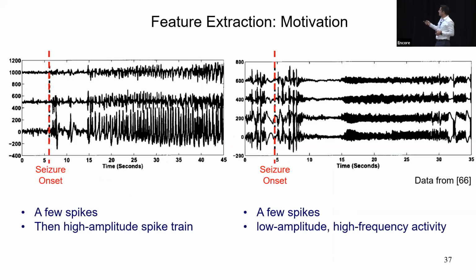Now, if you look at signals that are recorded from IEEG or intracranial EEG, where electrodes are implanted, we see that first of all, the manifestation of seizure is actually quite different. The signal magnitude and the resolution that we can get from the signal is quite different from scalp EEG, and again, from this patient to that patient, we have very different manifestations of seizures.